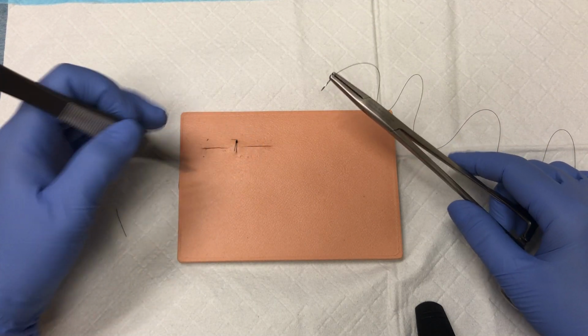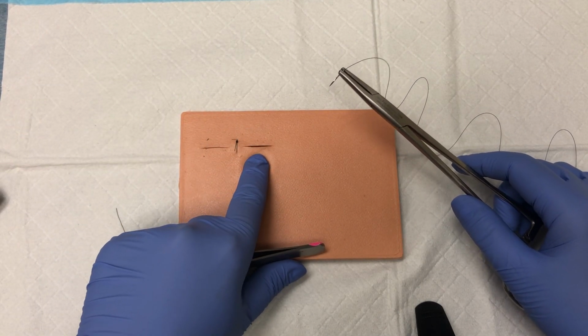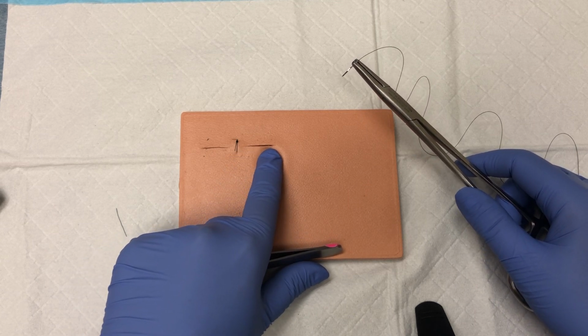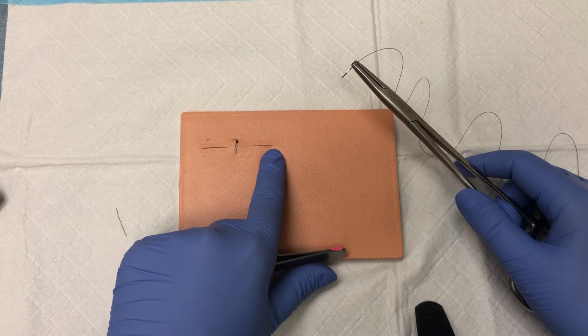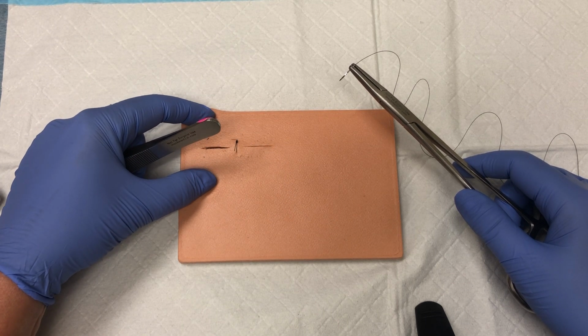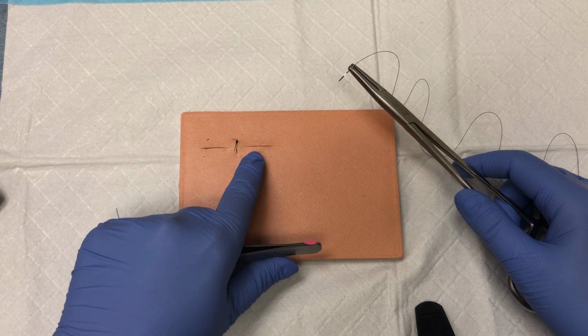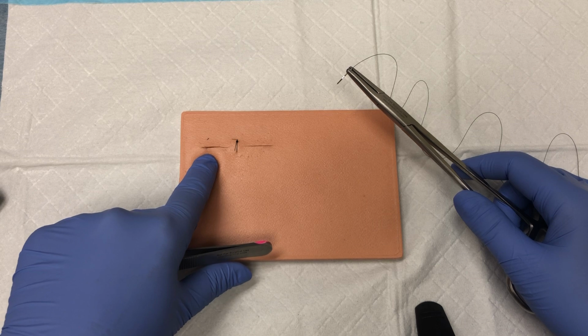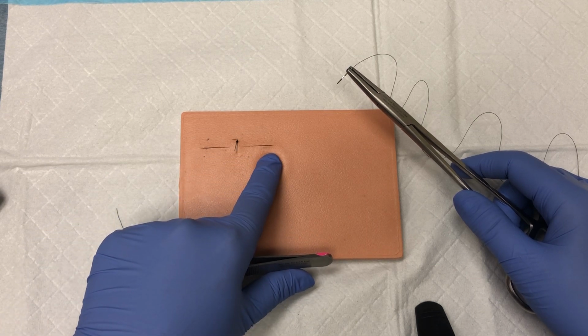Again, thinking of this, now you may look at this wound and say, well, it's not exactly 15 millimeters. So I may not need 3 in this area. Maybe I would simply need 2. But you hopefully can start to picture that now you can start to divide and conquer each side, and you know that at the ends you will be well approximated.